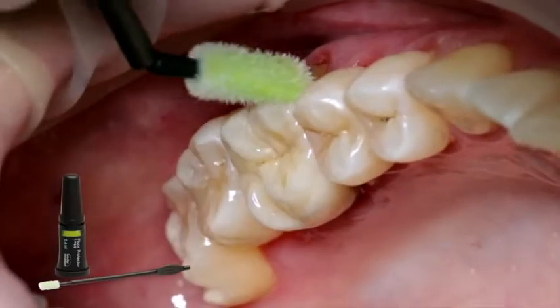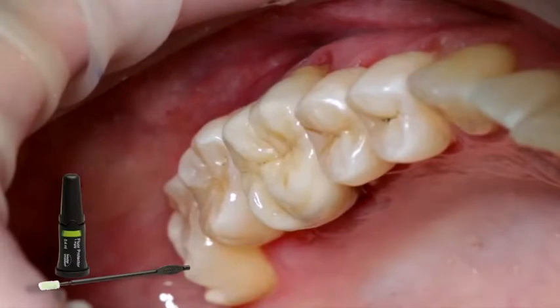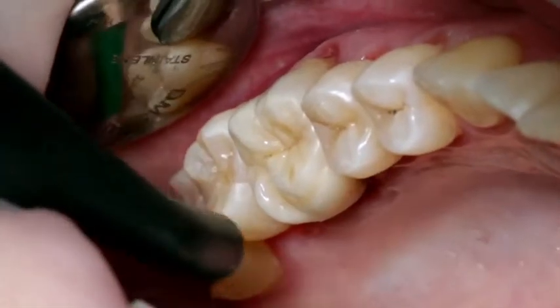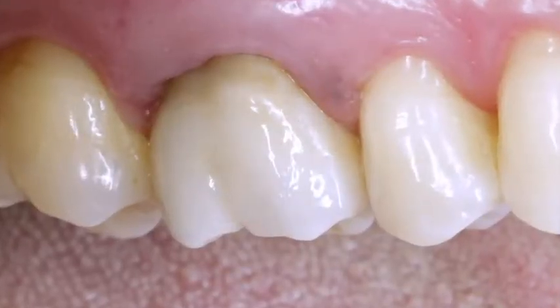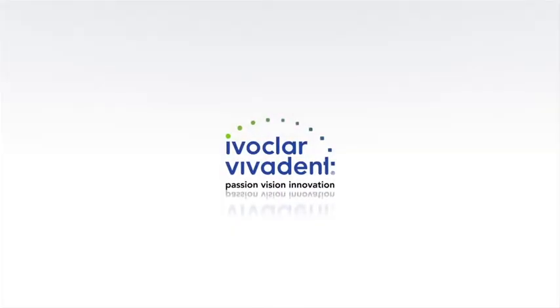Finally, apply a thin layer of Fluor Protector with a Viva brush or a brush. Disperse and dry the varnish with an air syringe.